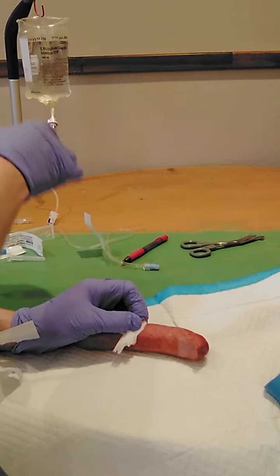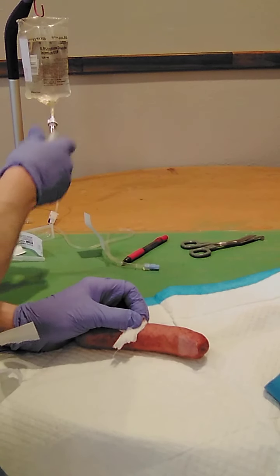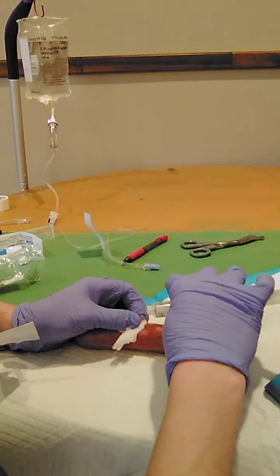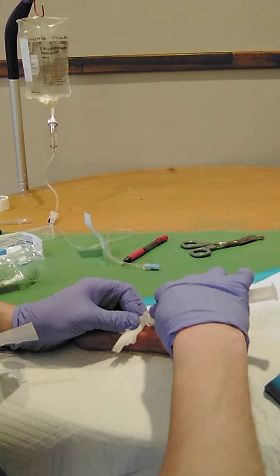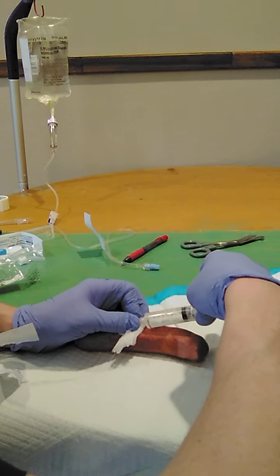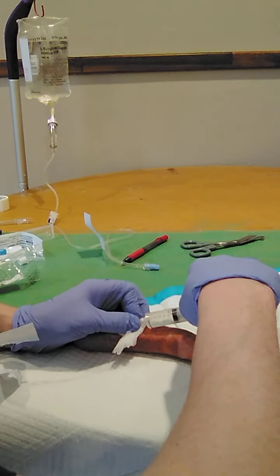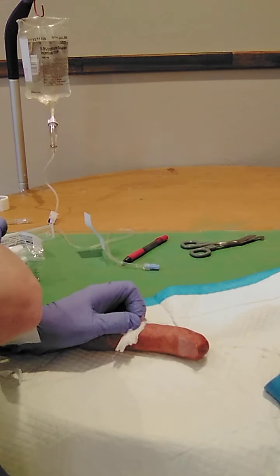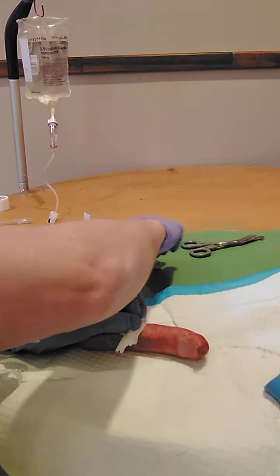Obtain this 5 milliliters of 0.9% sodium chloride for its saline rinse. To flush that. Okay, that's achieved now. It's going to go to its place.